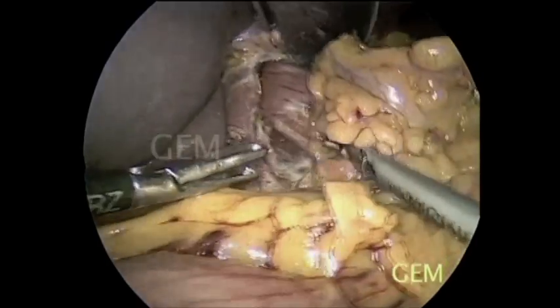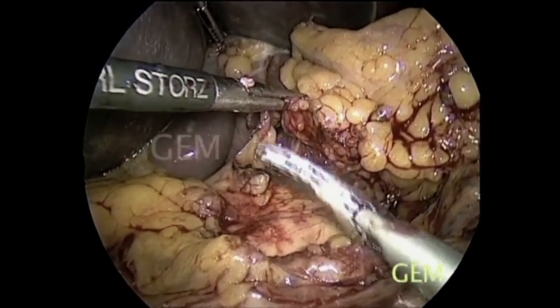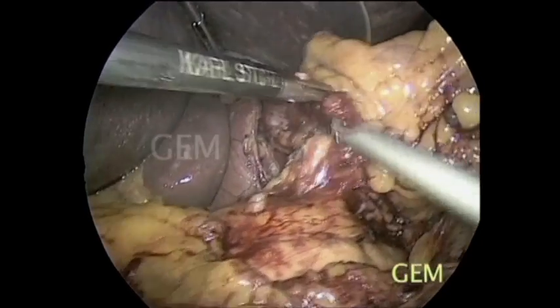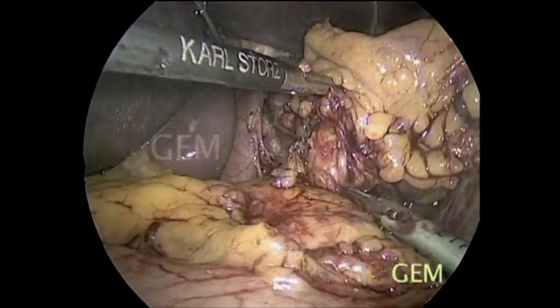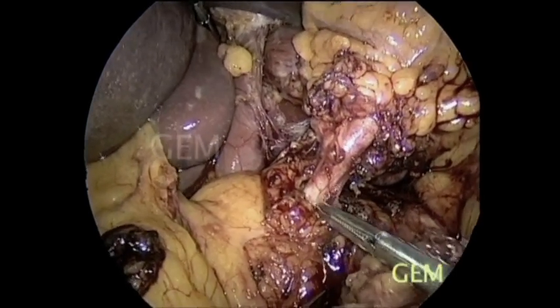This patient has advanced malignancy for which we already attempted preoperative chemotherapy. There is still a bulky growth. The left gastric vessel we are able to delineate, and we dissect at the origin.